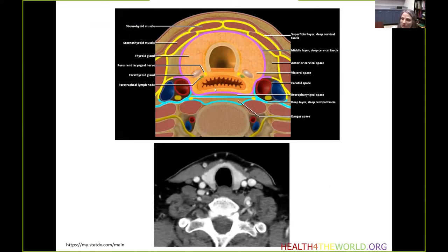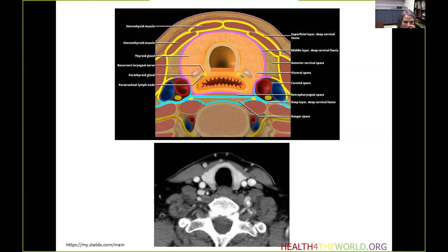The middle layer of the deep cervical fascia is also called the visceral fascia. Within the visceral space, we can see the airway — the trachea and esophagus — as well as the thyroid gland, parathyroid glands, paratracheal lymph nodes, and the recurrent laryngeal nerves running in the tracheoesophageal groove. On axial CT, we see the hyperdense, hyperattenuating enhancing thyroid gland, though smaller parathyroid glands or lymph nodes are not easily visible.